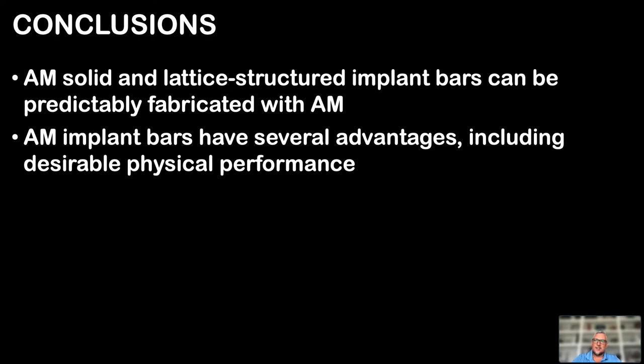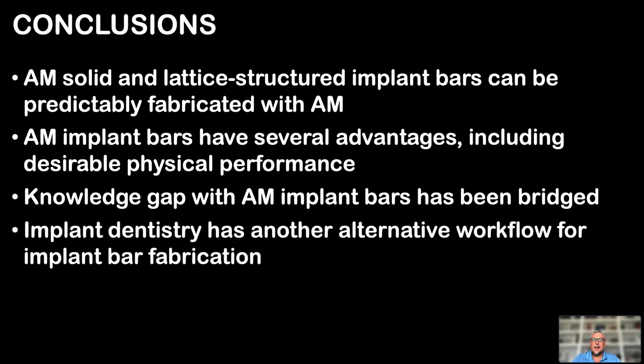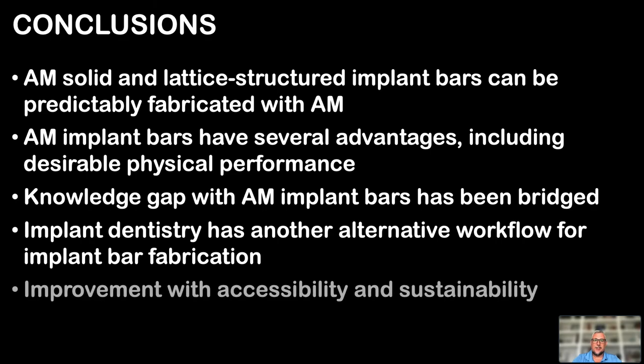Reduction in cost, reduction in time, reduction in workflow, increased accessibility, increased sustainability, and now we're seeing that we have very desirable physical properties as well. And this kind of bridged the gap that we didn't have to see, can we utilize this with implant bars? And what it does is it gives dentistry yet another option that we can provide for our patients.